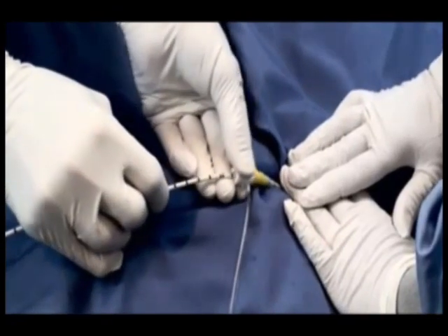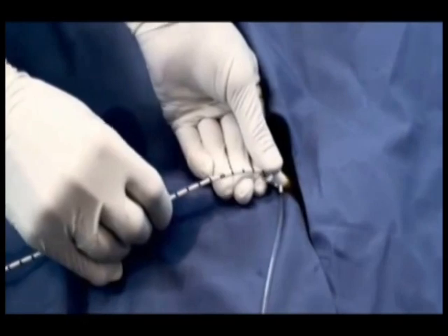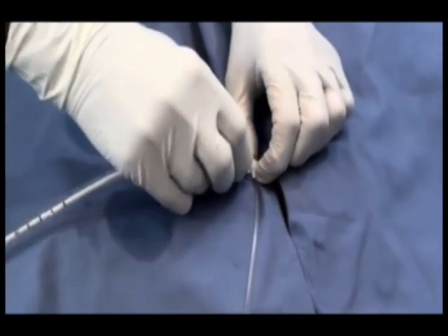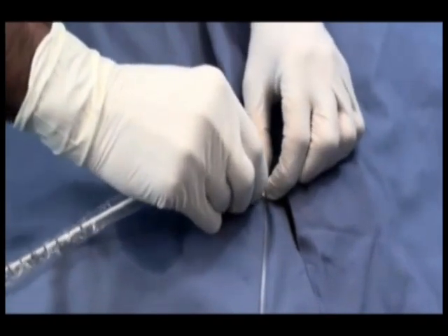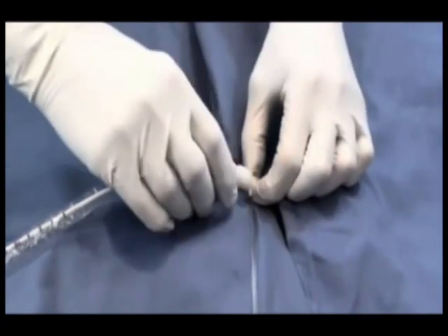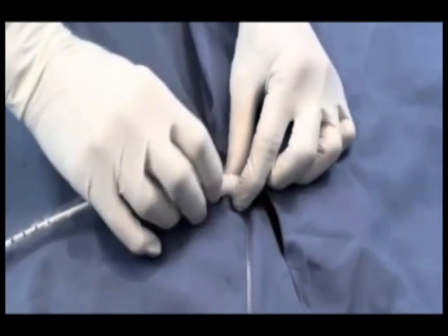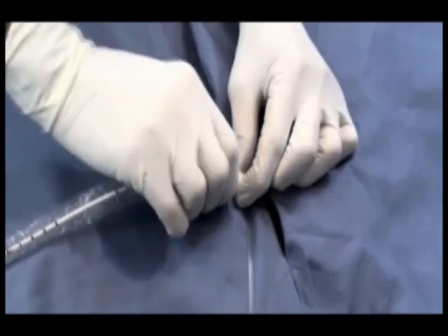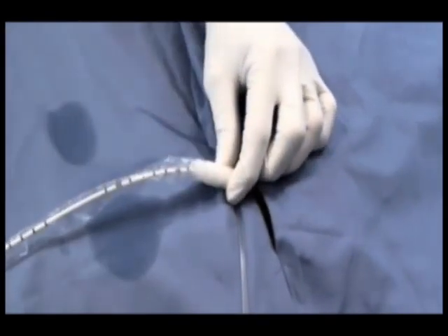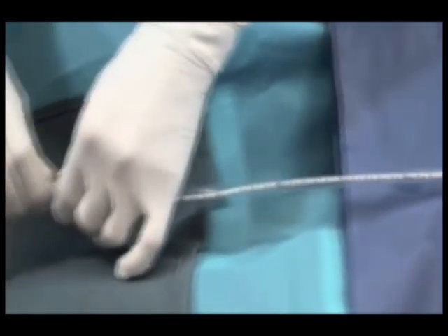Secure the yellow section of the repositioning introducer by suturing it to the skin using the provided eyelet. Slide the proximal end of the anti-contamination sleeve onto the yellow section of the repositioning introducer. Lock the anchoring ring in place by turning it clockwise. Secure the catheter shaft in place by tightening the connected anchoring ring. Carefully extend the anti-contamination sleeve to maximum length and secure the end by tightening the distal anchoring ring.